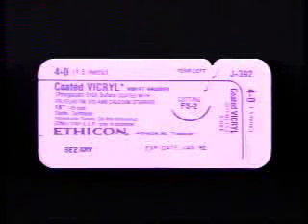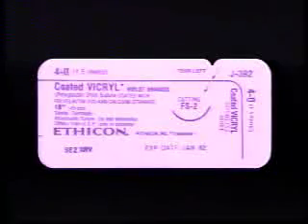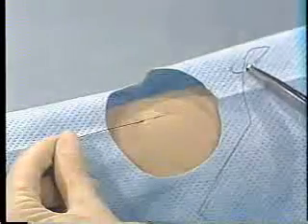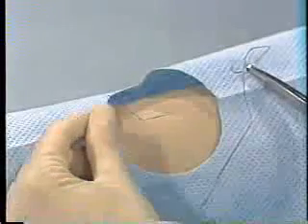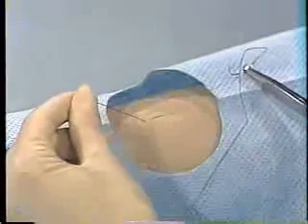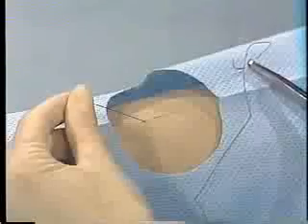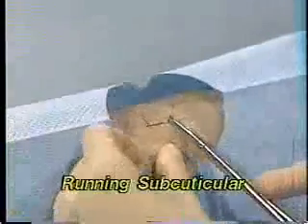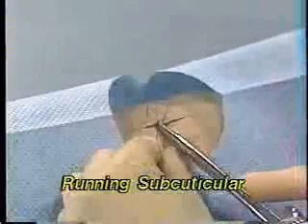Another technique is the running subcuticular, used for very clean wounds in areas of cosmetic importance such as the face. Be sure to use a cutting needle rather than a tapered. For purposes of this demonstration, black silk will be used for better visualization. When using absorbable suture, one end is anchored near one end of the wound and brought out at the very tip of the wound, but not through the outer skin.